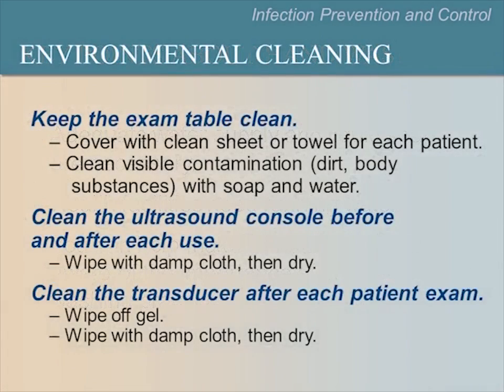The next set of guidelines relate to the patient environment and ultrasound equipment. These are measures to prevent patient-to-patient transmission of infectious diseases. First, keep the exam table clean. Cover it with a clean sheet or towel for each patient if available.